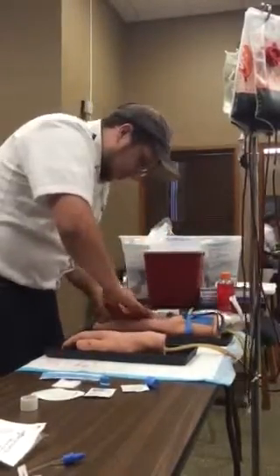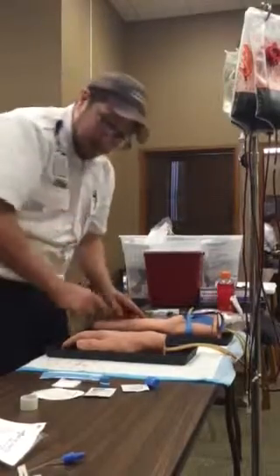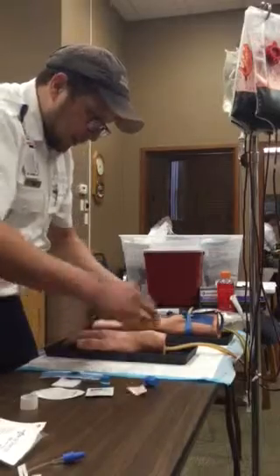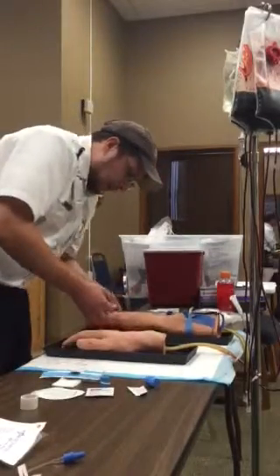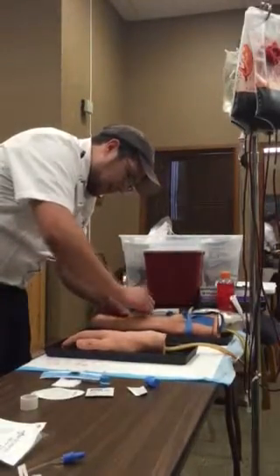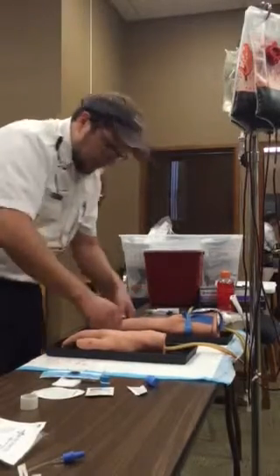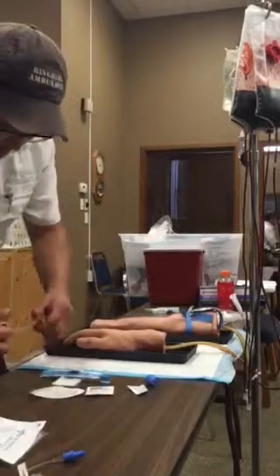I'm going to palpate for a suitable site there. Right, looks good. I'm going to put one right there. I'm going to go ahead and clean my site in a circular motion going out. And while that's drying, I'm going to rip off my tape.